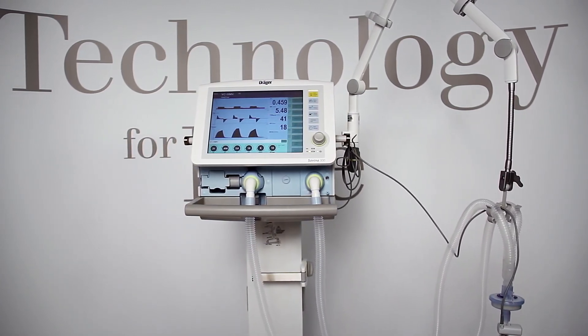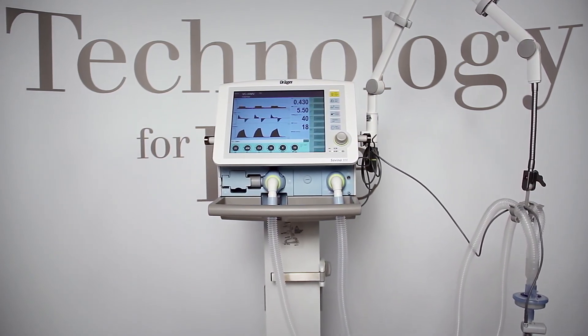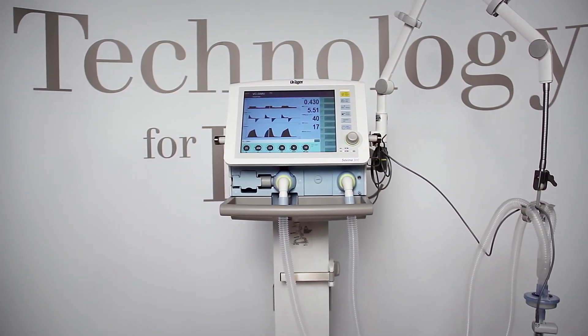We hope we've given you an interesting insight into the ingenious world of the Savina 300. You will find more information in our instructions for use and on our website.